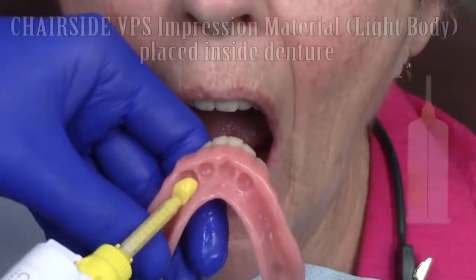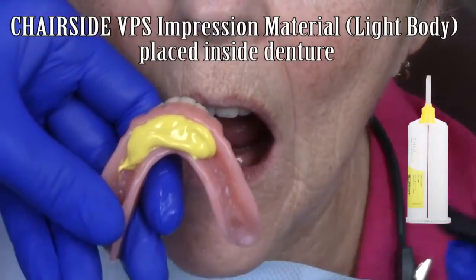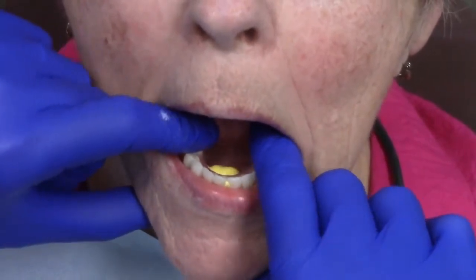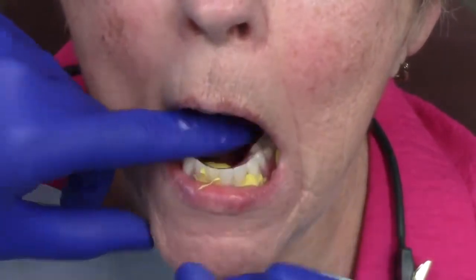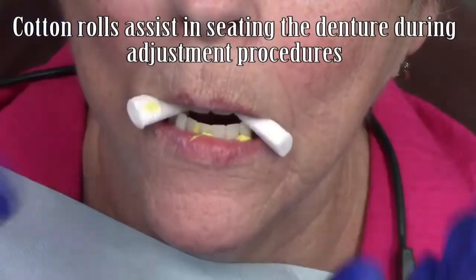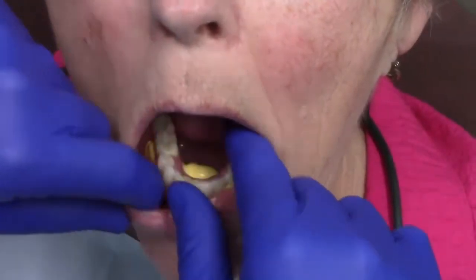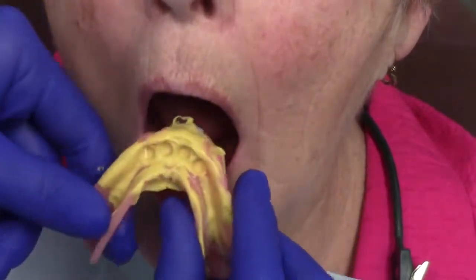Chair side light body PVS impression material is injected into the intaglio surface of the complete denture. Once injected, the denture is seated back onto the edentulous ridge, ensuring complete adaptation of the denture. Sometimes the pressure of the PVS material can be great, so I have the patient biting down on cotton rolls to assist in complete seating. This procedure allows you to see if there's any contact of the denture to the Locator RTX housings.